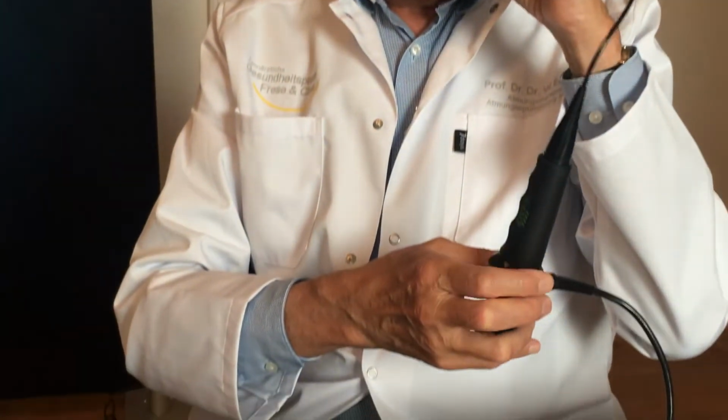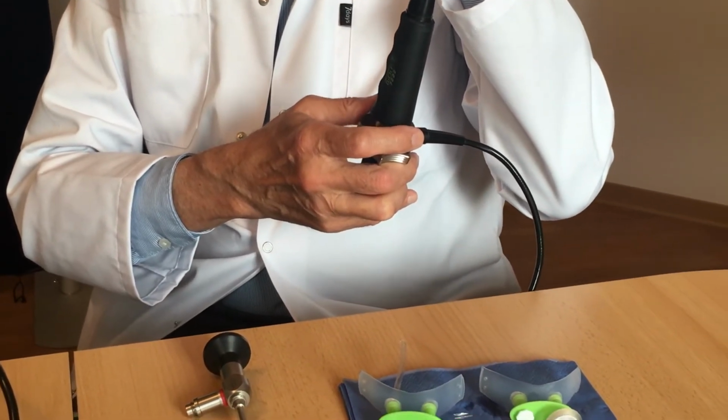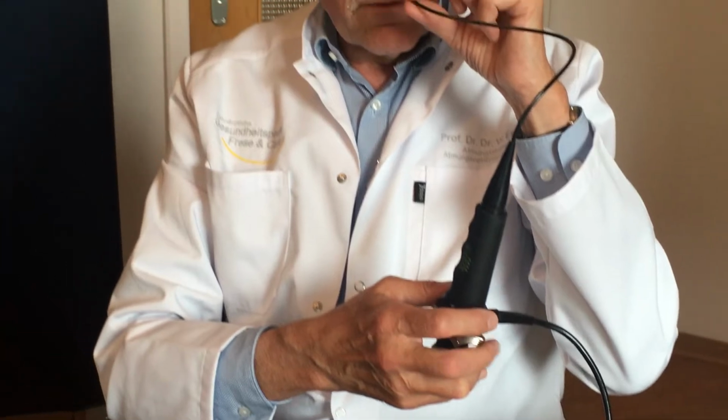We can get the endoscopic pictures later on, but this is only a demonstration of the position of the endoscope during the maneuver of uplock.